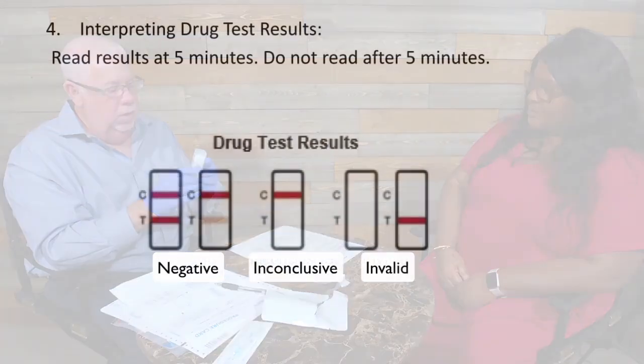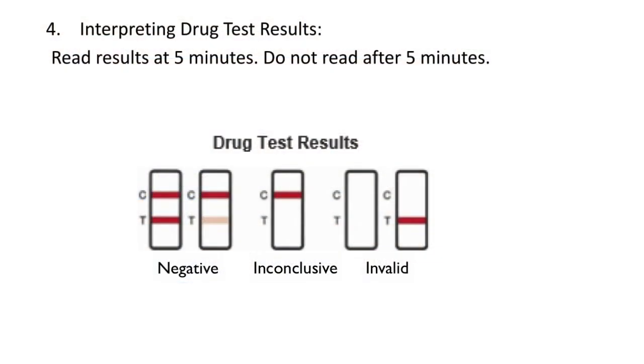Okay, Shar, welcome back. Thank you. And we've got your T-Square oral fluid drug test. And it's a successful test. And so we'll get the results over to your employer. And on the way out, you can wash your hands. All right. And I'm just going to mark that this is all negative. Okay.